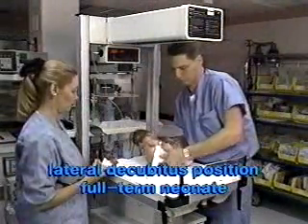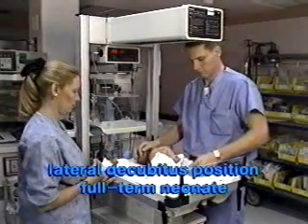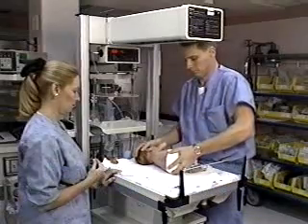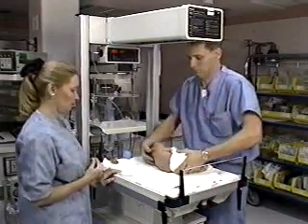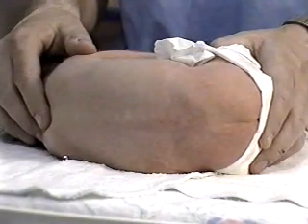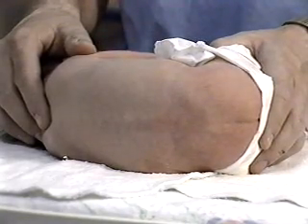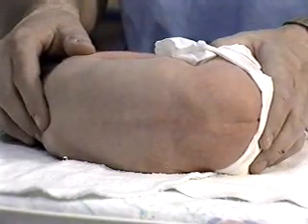In this first demonstration, we will use the lateral decubitus position and a full-term neonate. This neonate required a lumbar puncture to evaluate for possible meningitis. For the lateral decubitus position, the assistant places the infant on his side, flexes the knees to the chest, and bends the head, being careful not to occlude the airway.